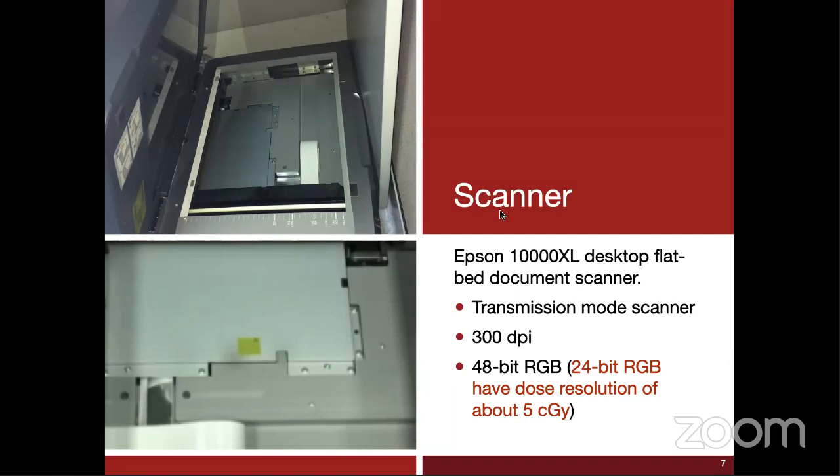300 dpi, dots per inch, sorry. That's the resolution we use. And that's why we like this scanner. It's a 48-bit RGB.